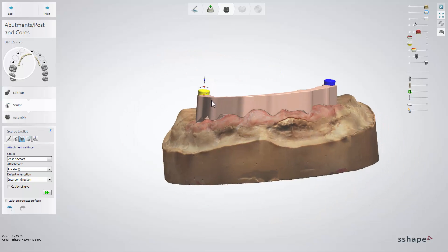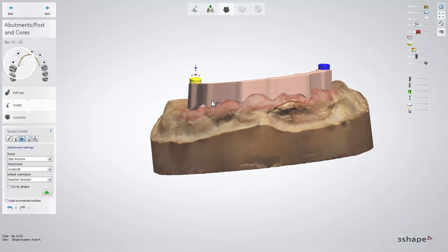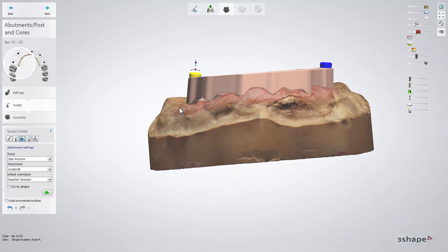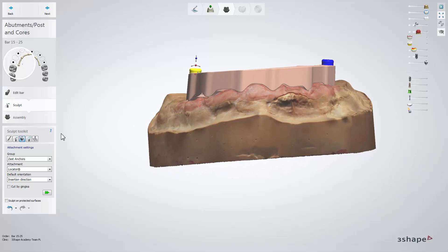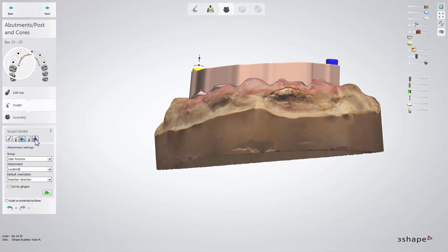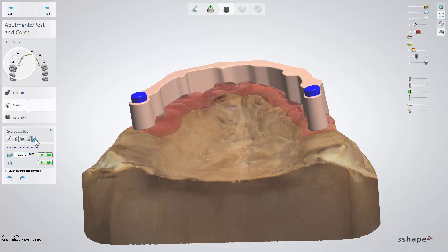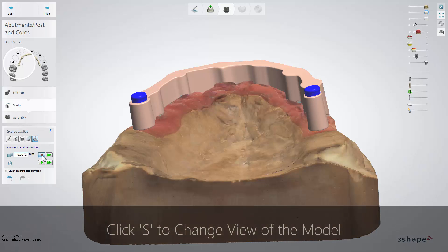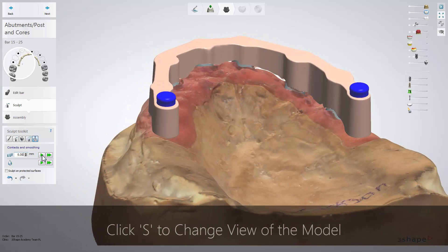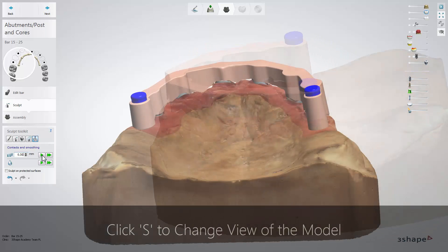It is quite important to have a bar design in the correct relation to the gums. The sculpt toolkit's contacts and smoothing option allows you to set a distance to the gums for the bar interface. The whole bar structure is now parallel and a secondary part can be easily placed on top.